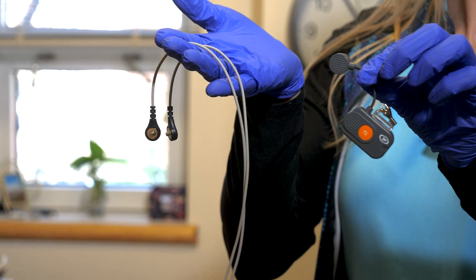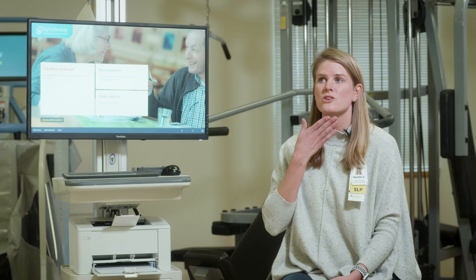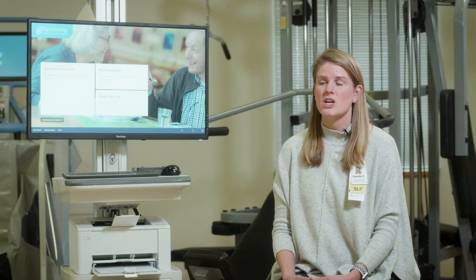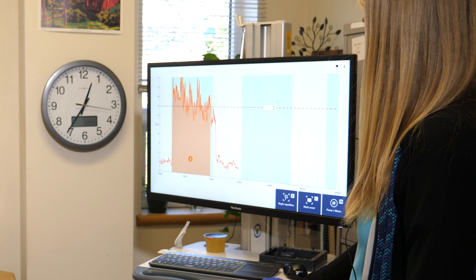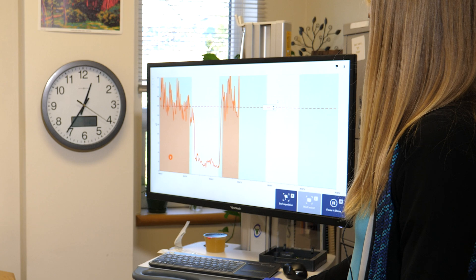The way the Synchrony system works is that you have a pair of electrodes placed underneath the chin above the throat, and those electrodes measure muscle activity. They're connected to a Bluetooth system that then displays that information onto our screen so we can see muscle activity used in various oral motor movements, swallowing movements, and so on.